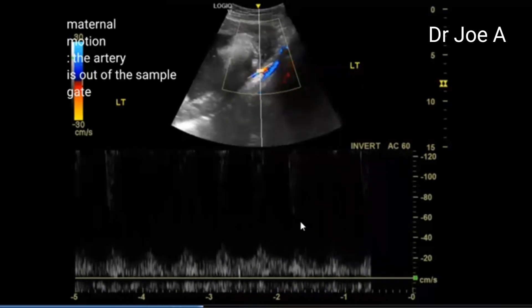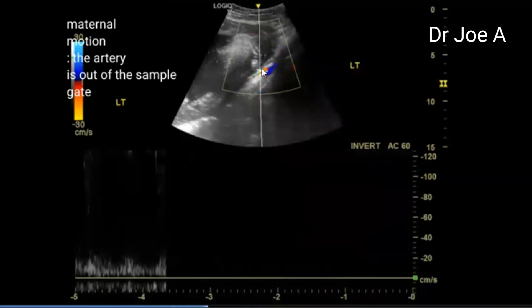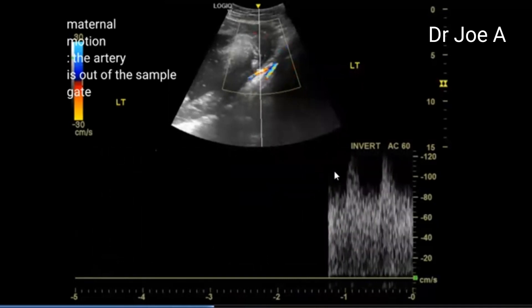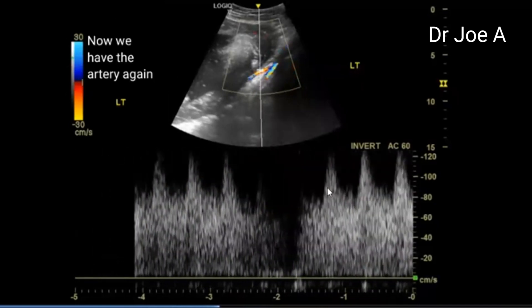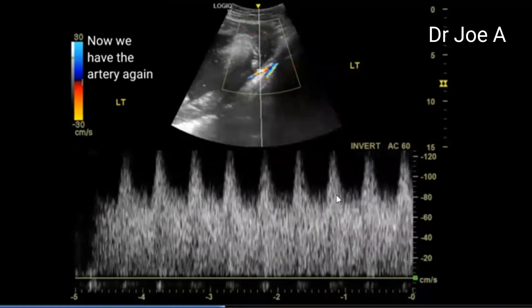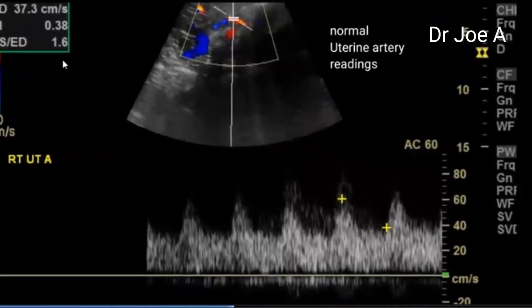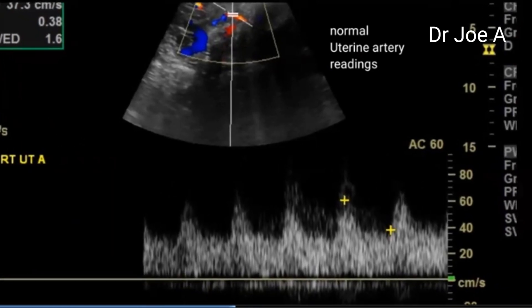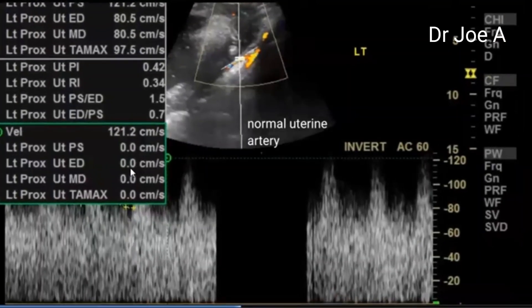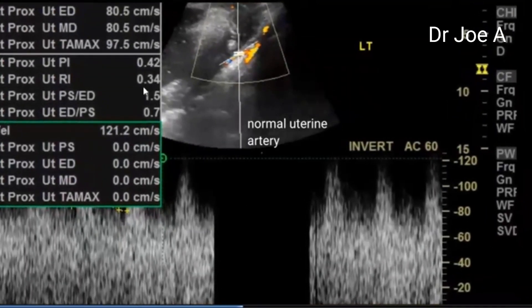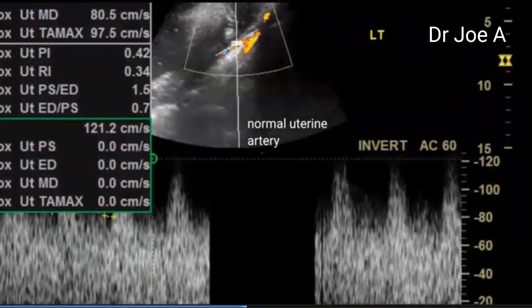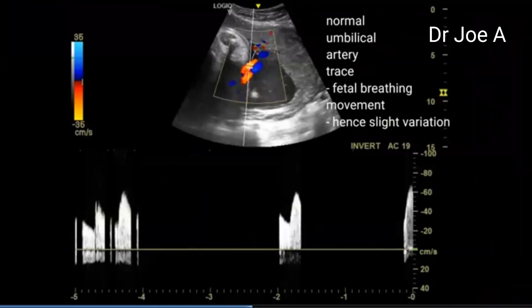We try again to get the waveform. That is the uterine artery, and that is the external iliac artery. On the left side, we get a good uterine artery waveform with very high diastolic flow. The RI on the right side is only 0.38. On the left side, the resistive index RI is 0.34, which is also very good. So the RI is very low, indicating good diastolic flow and low resistance flow in the uterine artery on both sides.